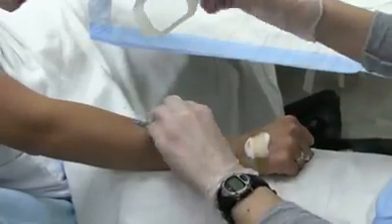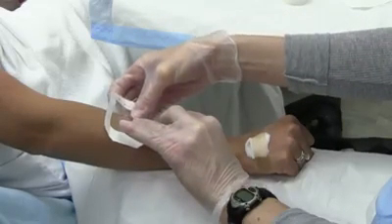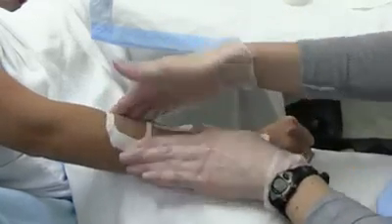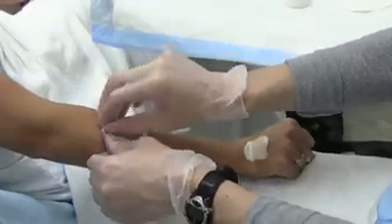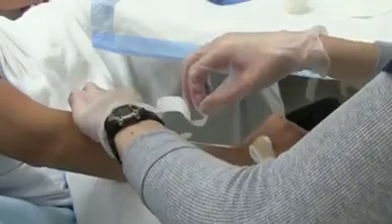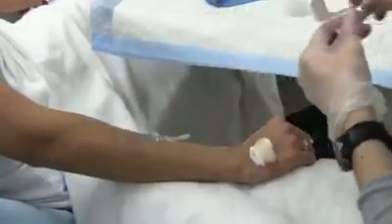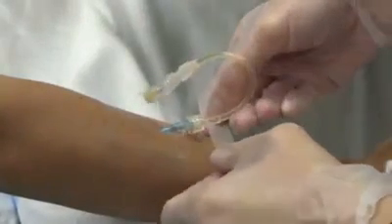If preceding steps fail to distend the vein, remove tourniquet and wrap the patient's extremity in a warm, moist towel for about 10 to 15 minutes. You may also minimize insertion pain as much as possible by using ice or an intradermal injection around the site that you're going to venipuncture.